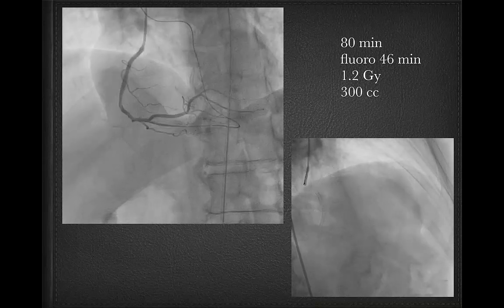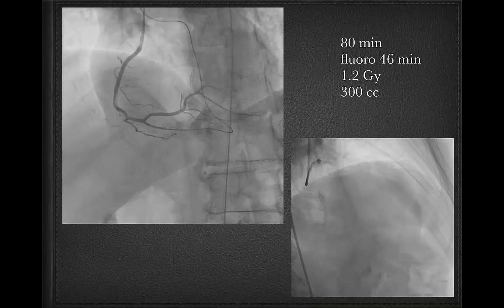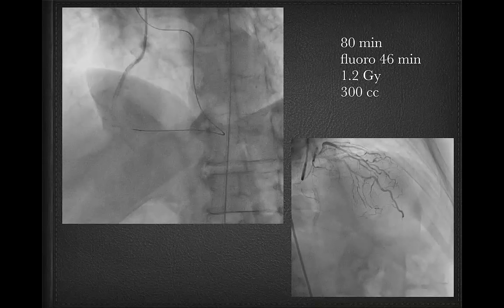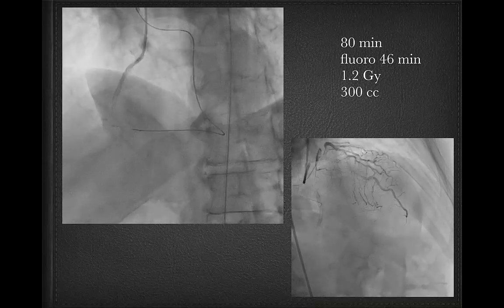It's a phenomenal case. I guess it shows the challenges with having a flush occlusion. So here, retrograde worked very well. You got true lumen, and everything was great. So that's your go-to technique for all these flush ostial RCAs from now on, right? Absolutely.